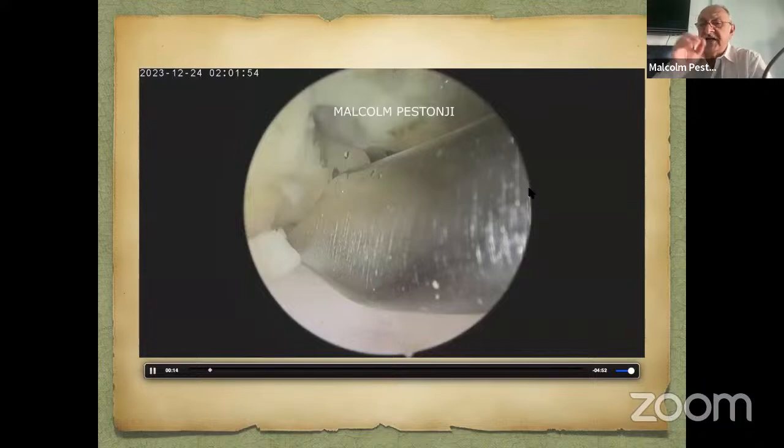And now with a gentle dissector, I will walk through and open up the flavum. No force, no pressure, no nothing needed, no stressing the flavum, accidentally pushing a scope through. It's a one in a million chance, but that also should not happen. So nicely done. Now when I introduce the Kerrison, I will lift this flavum, check for the first bite that there is nothing adherent over there, and then continue with the rest of the flavotomy.